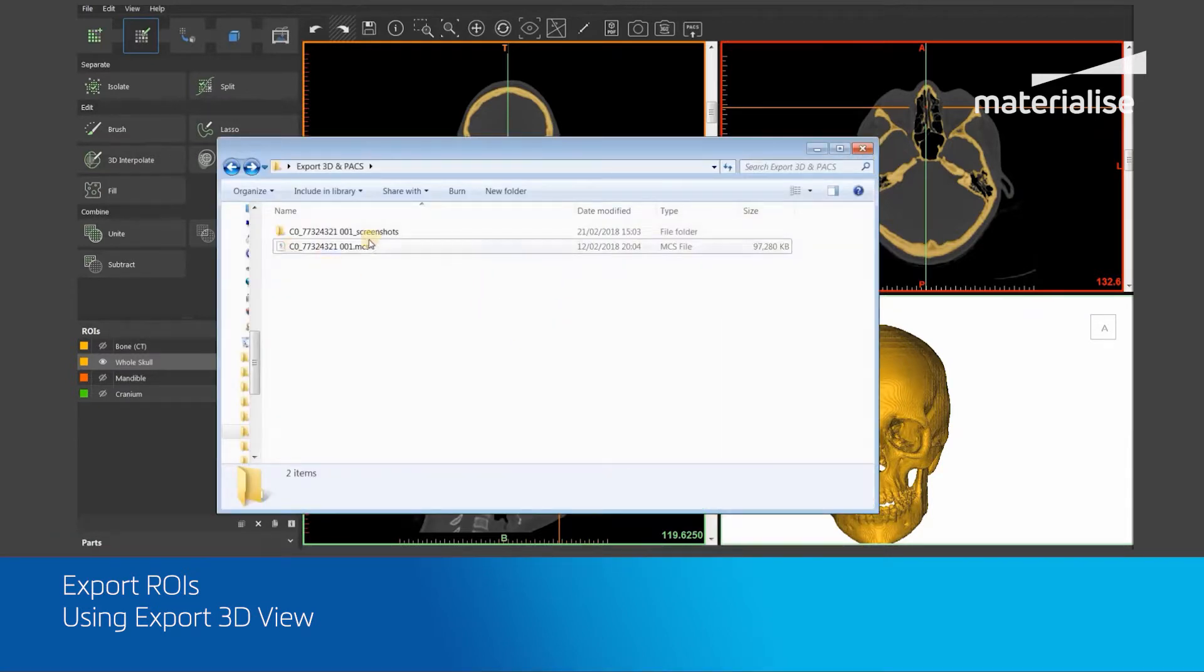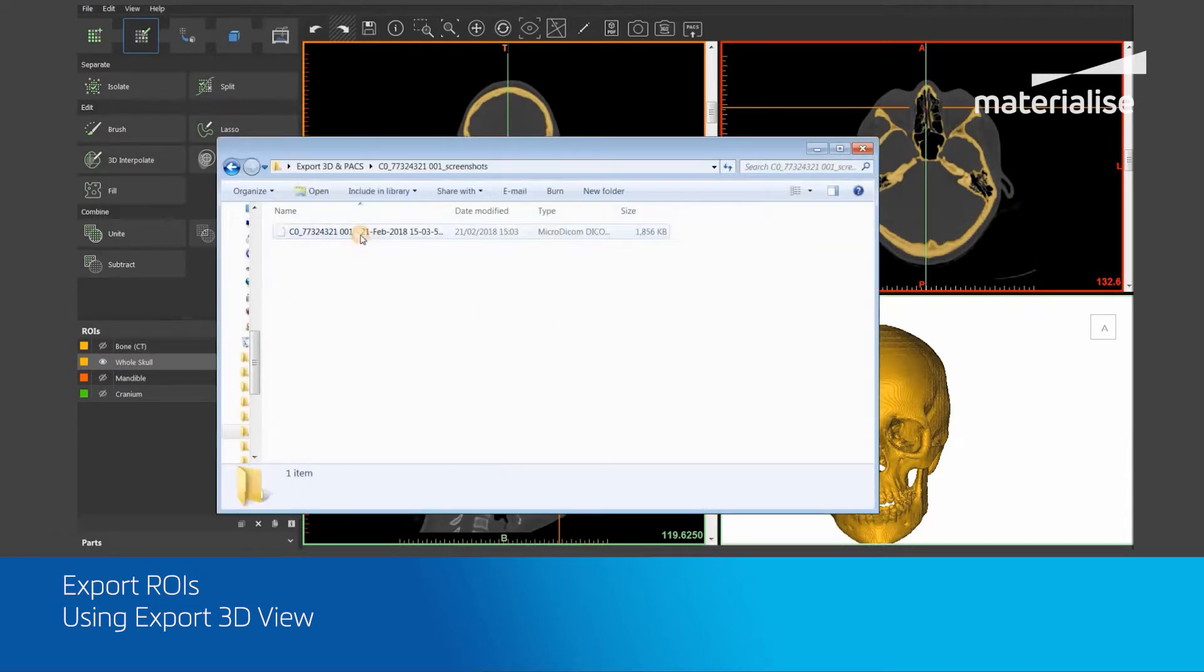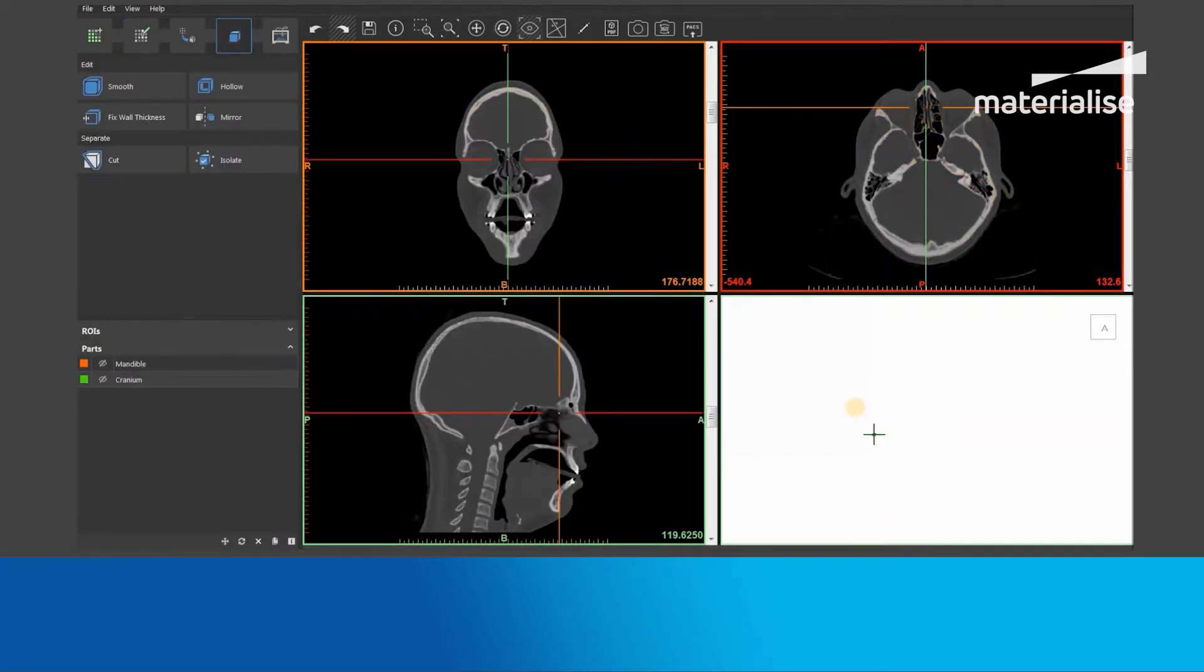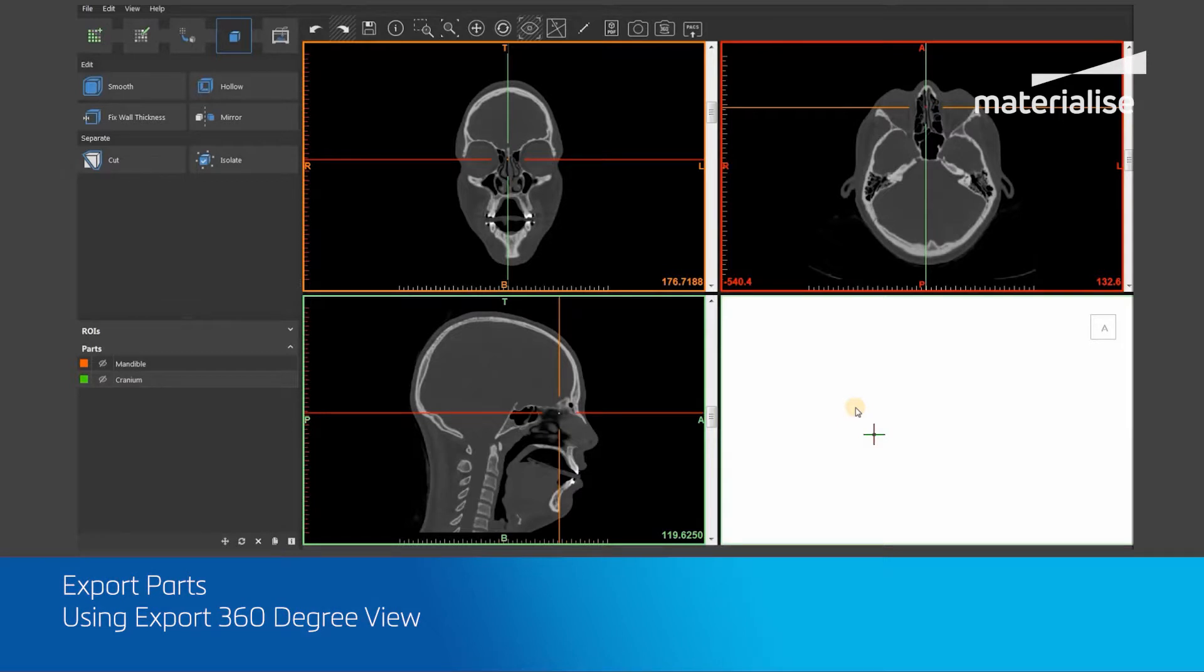Now I will show you how to use the Export 360 Degree View tool within Mimics Imprint. You need to first make sure that your required part models are displayed within the 3D viewport in the bottom right-hand corner. In this case, my required parts are mandible and cranium.